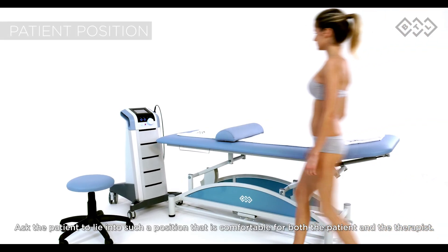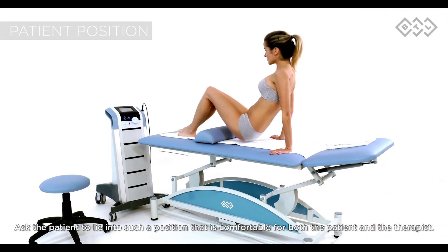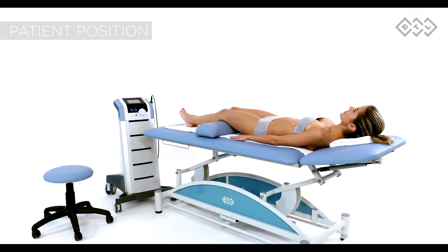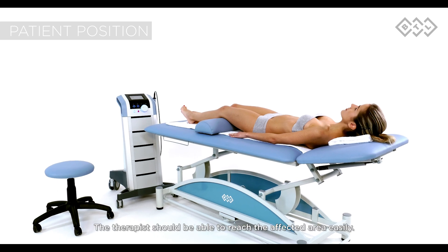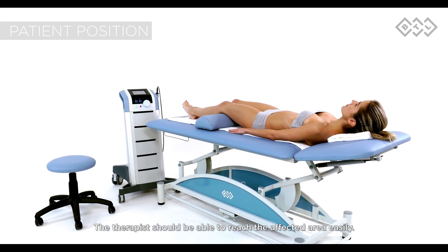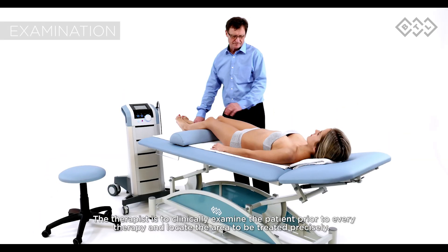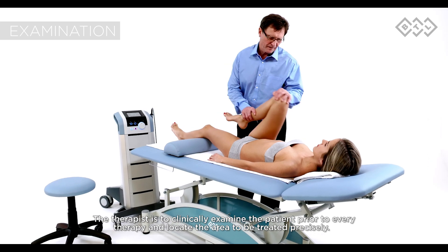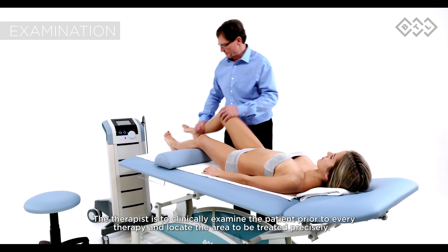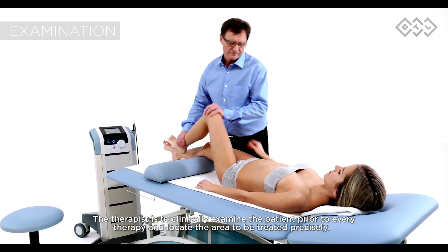Ask the patient to lie in such a position that is comfortable for both the patient and the therapist. The therapist should be able to reach the affected area easily. The therapist is to clinically examine the patient prior to every therapy and locate the area to be treated precisely.